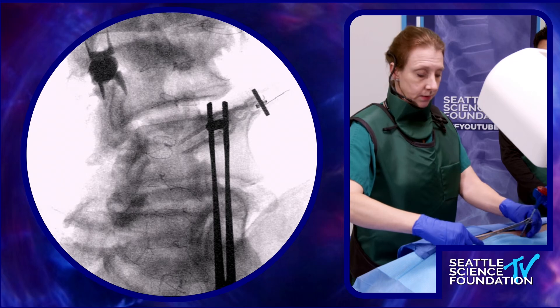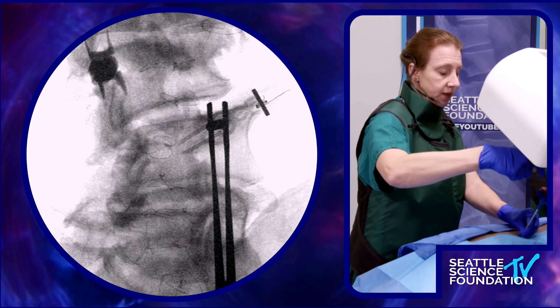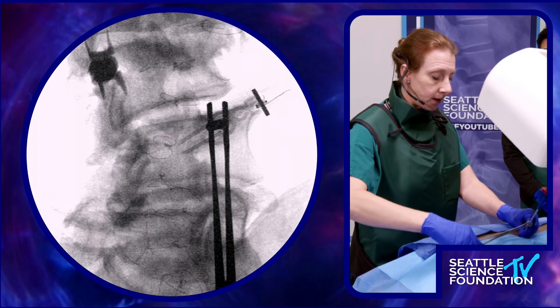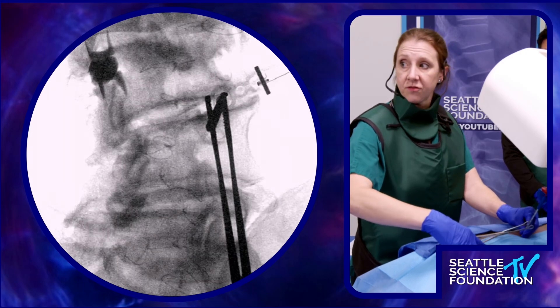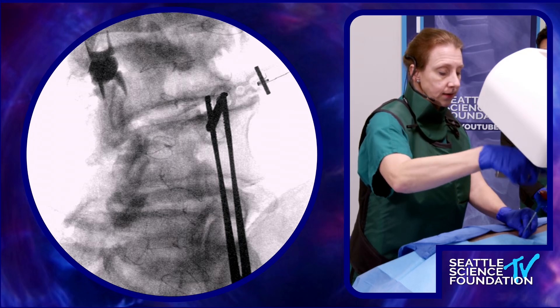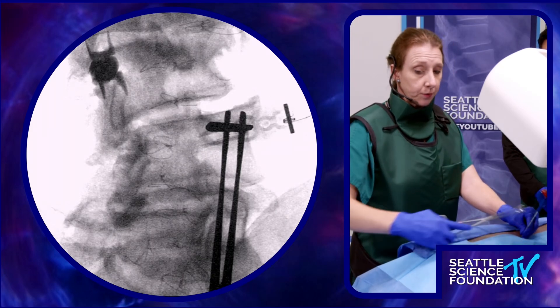What you'll see I'm doing is starting lateral, trying to traverse through the column of pedicular bone from lateral to medial. I'm also considering the cephalocaudal orientation of my introducer, because the pedicle in this instance is pretty high on the vertebral body and I need ultimately to get that radiofrequency probe into the midpoint from a cephalocaudal perspective as well.